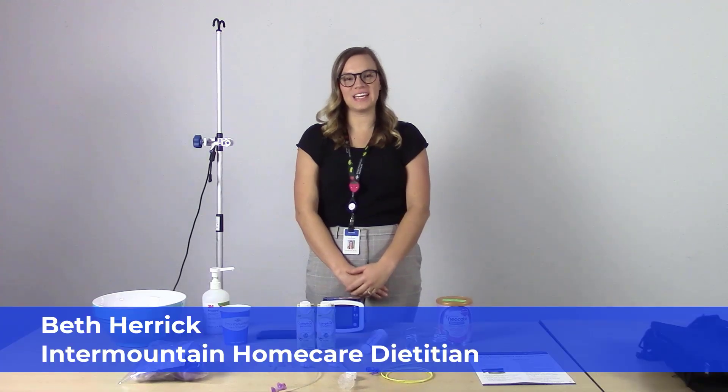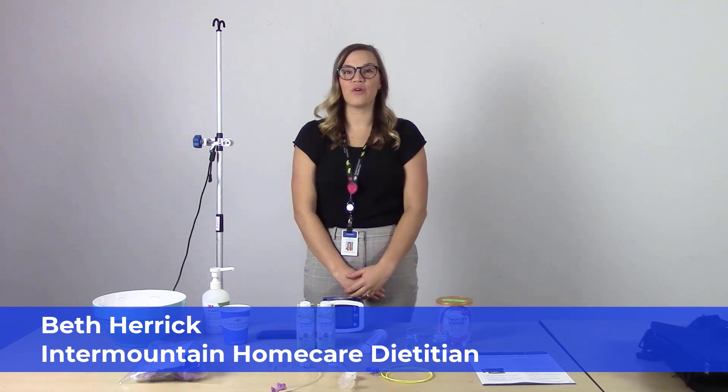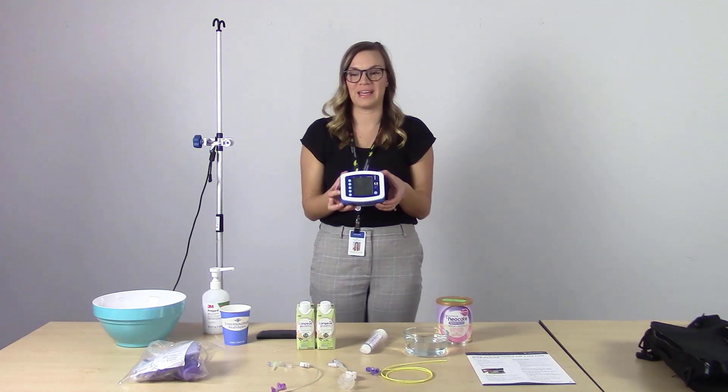Hi, my name is Beth and I'm one of the dietitians from Intermountain Home Care and Hospice. In this video, we will go over how to give an enteral feeding with the Covidien Kangaroo Joey Pump with the Feed and Flush Bag Sets.